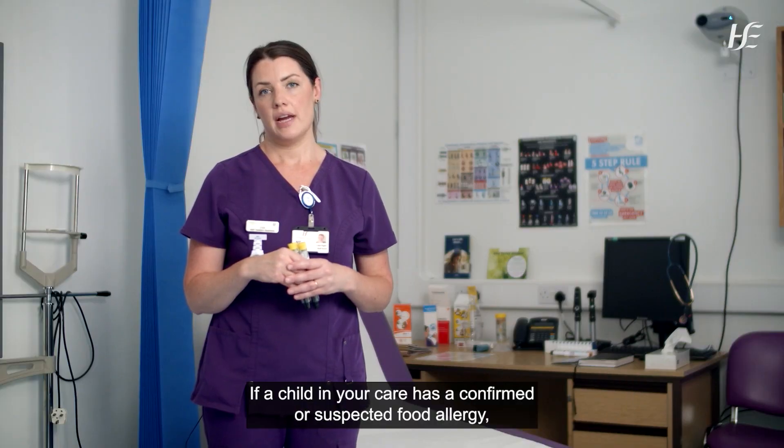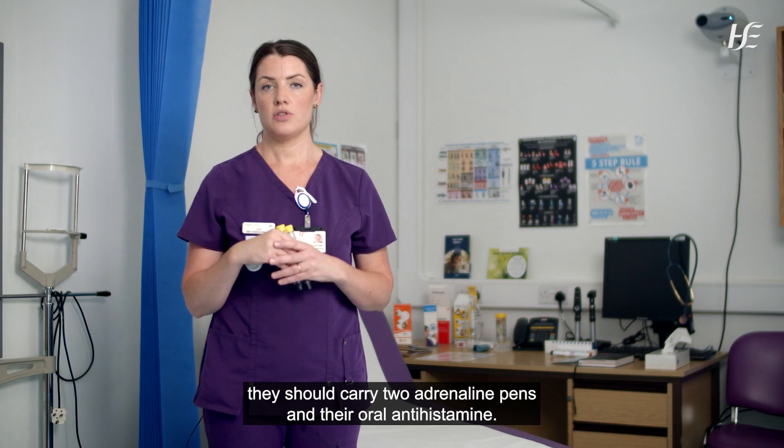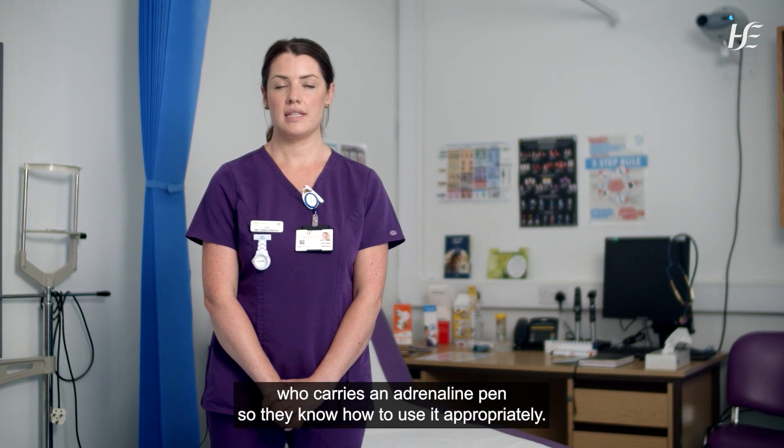If a child in your care has a confirmed or suspected food allergy, they should carry two adrenaline pens and their oral antihistamine. That brings us to the end of our demonstration. Please feel free to share this video with anyone who cares for a child who carries an adrenaline pen so they know how to use it appropriately. Thank you.